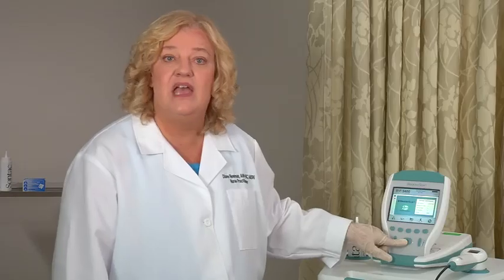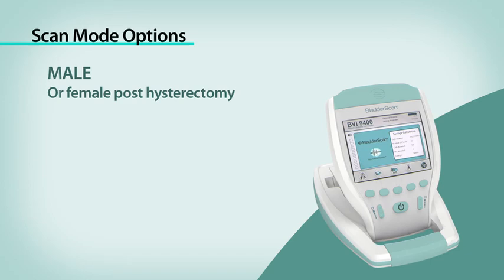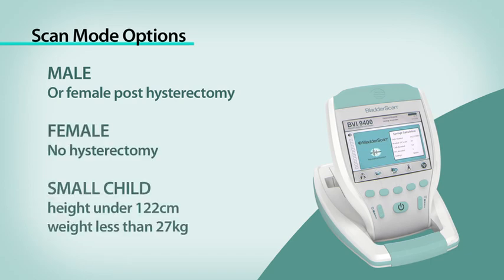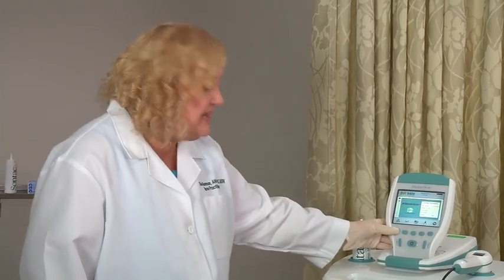Turn on the bladder scan by pressing the on-off button, which is right here. The Bladder Scan BVI9400 is designed to scan in three specific modes: male patient, female patient, and small child. A female patient who has had a hysterectomy should be scanned in the male mode, shown as a bladder icon. To begin, first select the proper exam mode to ensure the accuracy of your scan. Press the mode button repeatedly until the right setting appears.